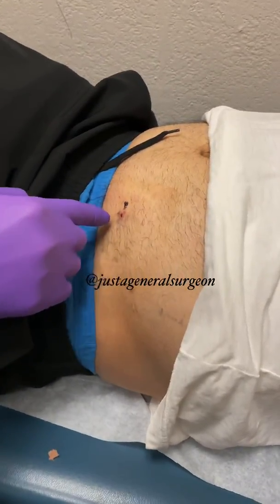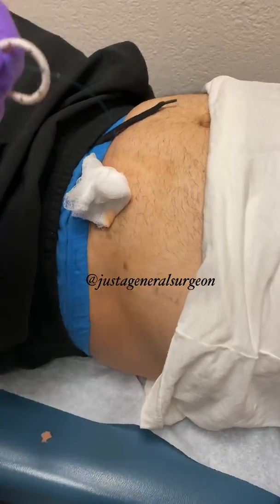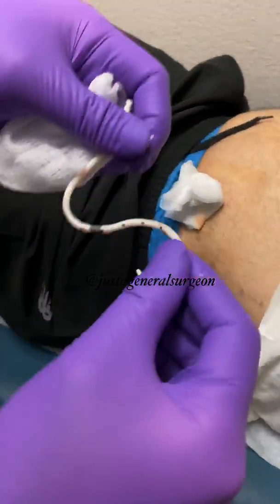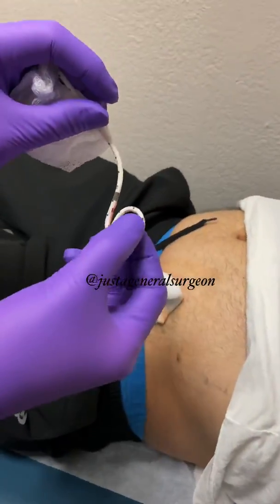We just put a little dressing over that small hole, which will heal in the next day or so. And this is what was inside of you — it kind of curls up.